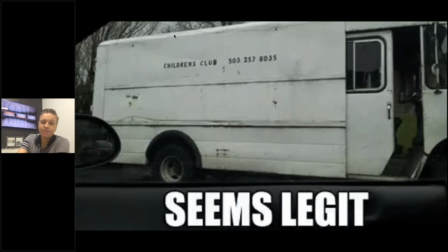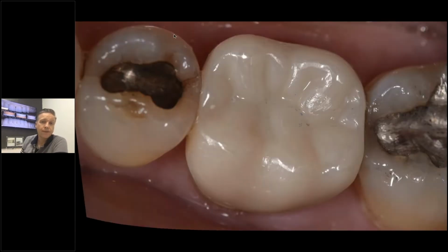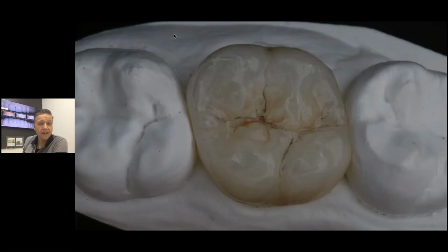And you see parallels there, because my doctors send their grandma, their mom, their own case to us, but not the other cases. They go somewhere else, maybe even offshore. I think that's the point where we have to say goodbye to that result and go more towards something like this. For example, a Zolid HT plus zirconia full contour, just stain and glaze, and that can be pretty aesthetic.